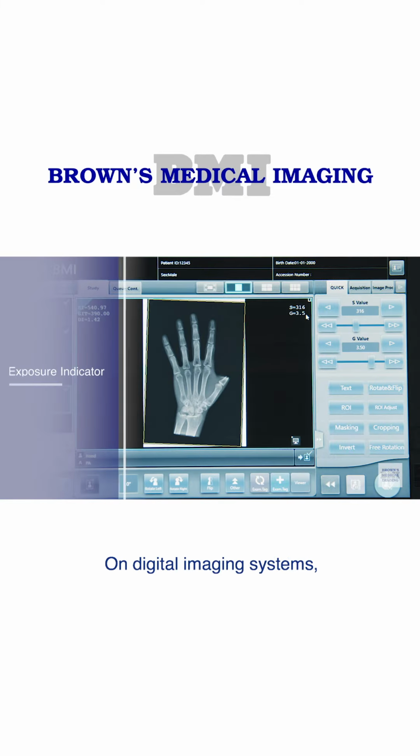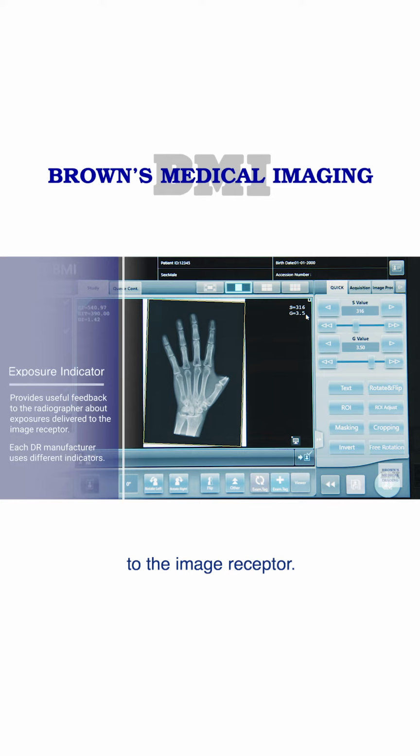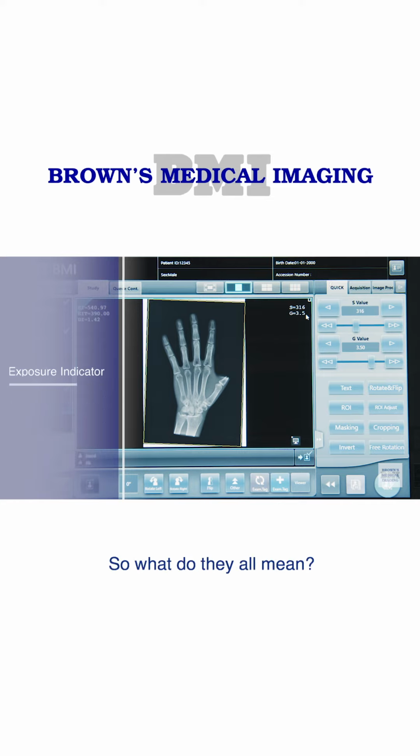On digital imaging systems, an exposure indicator provides useful feedback to the radiographer about exposures delivered to the image receptor. Each DR manufacturer uses different indicators. So what do they all mean?